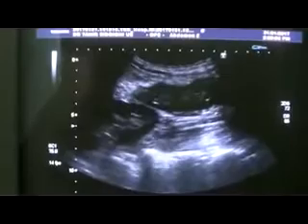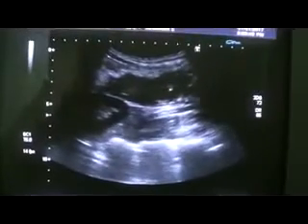Now I'm moving down. This is the upper margin of this bowel mass. This is the lower pole of the right kidney. This is the mass — a bowel-related mass. This is the wall of the bowel, and the bowel wall, you can see, is regular — not irregular. It measures approximately 5 mm. More than 5 mm is considered to be more pathological.